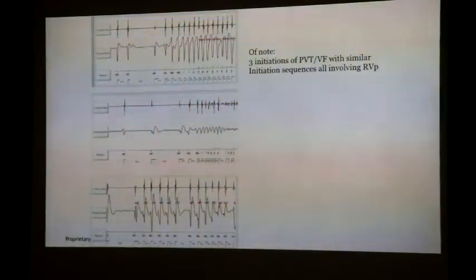Turn the pacemaker off. He goes low. Yes, he does. But let's say we haven't got AV block here. He's difficult to manage because he has got AV block. So does it change where he's pacing from?